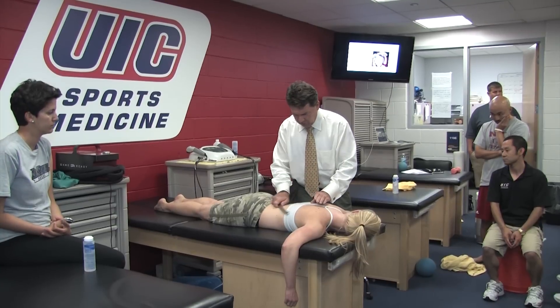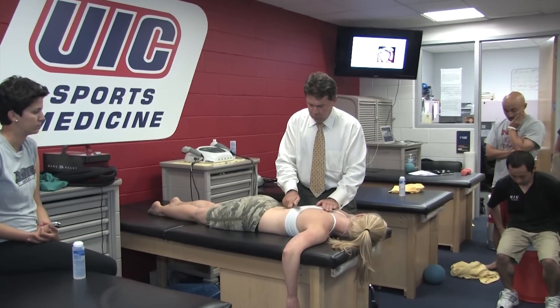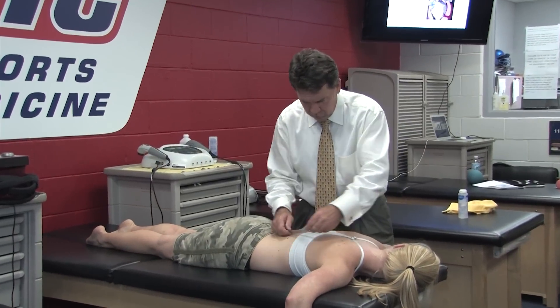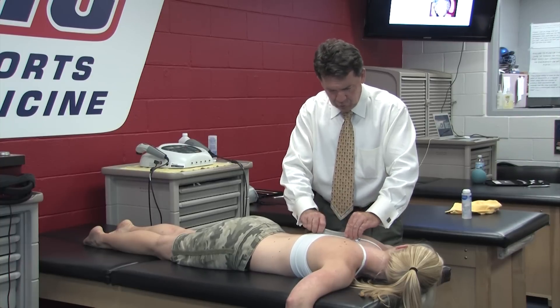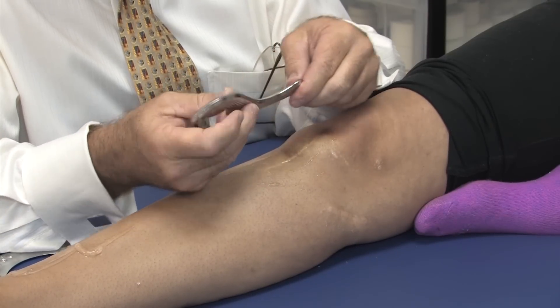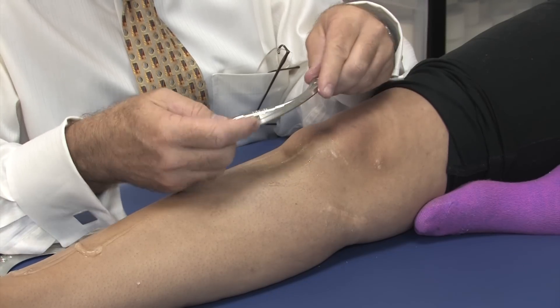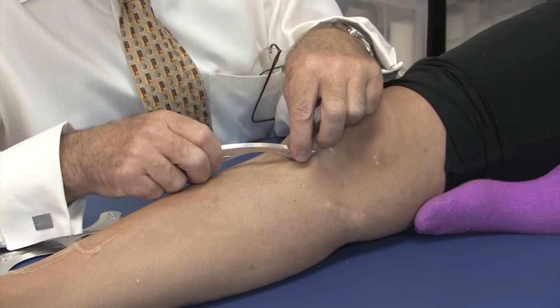I can come through here and use and pivot through the tissue. I can use two hands, I can come both ways, I can come back this way. I am going to be scooping away — scoop it and brush it. I can use this end to find the part that fits best, and I can come over here and use the bump and come in a different way.